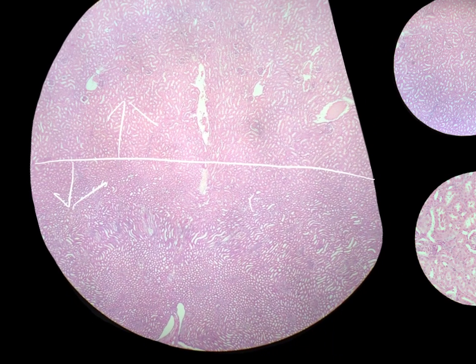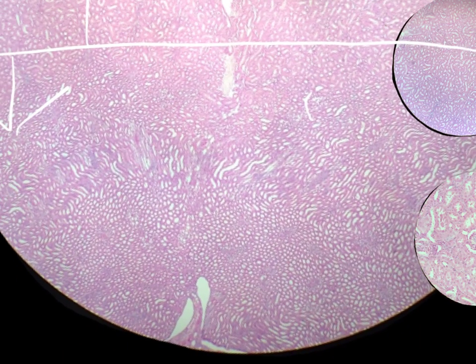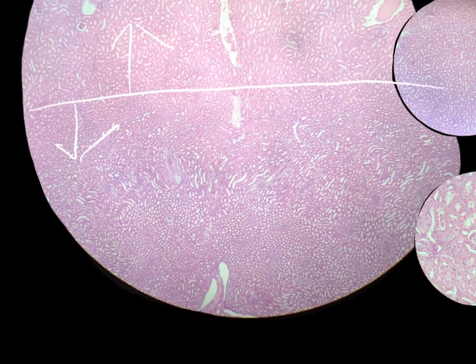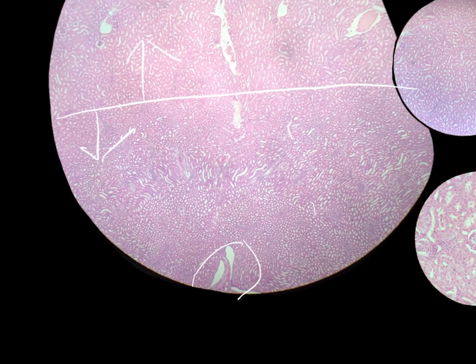And so if you look at that, you can see the big difference is the glomeruli. But as you get into the medulla, you see these much larger tubules, which are going to lead to structures which you can't see in total here. But these big openings, these cracks that you see here, that's getting down towards what's called the renal papilla. And that's where filtrate is actually going to filter into the minor calyces of the kidney. So let's get this guy out of the way. Really just looking at introducing the glomerulus with this one here and the difference between the medulla and the cortex.